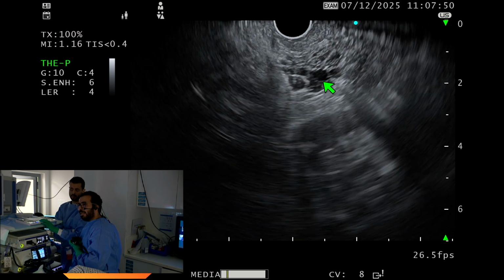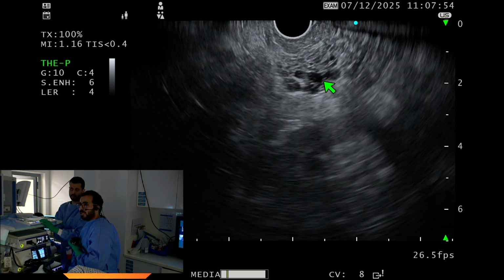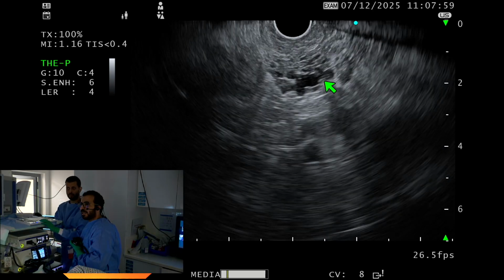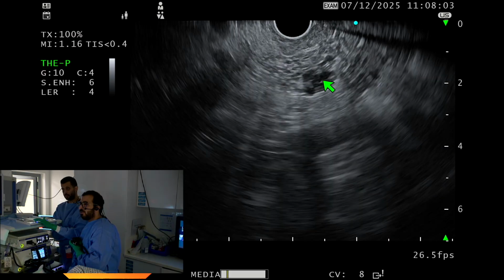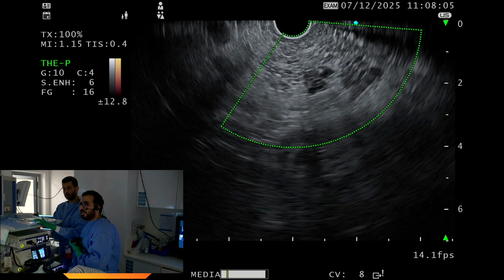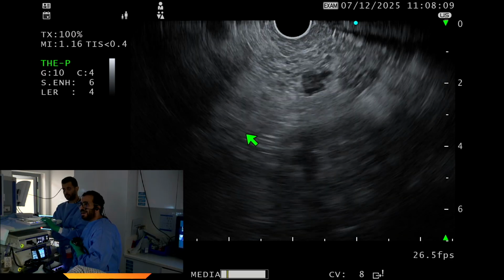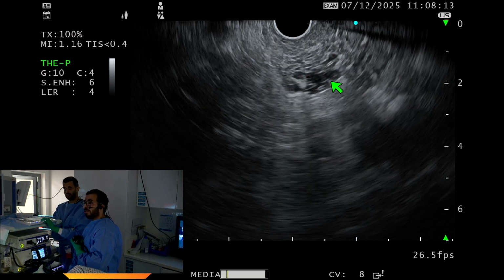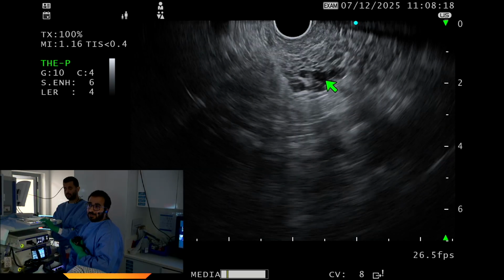So I think it looked like serous cystadenoma in this examination, especially in this view, with one macrocyst around 1 centimeter here. However, I agree with you, Nawal, the patient is young and his MRI showed other cysts. And in the MRCP report, this one at the head communicates to the PD. I mean, we don't see clear communication.